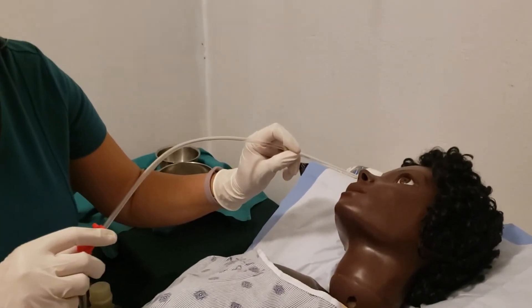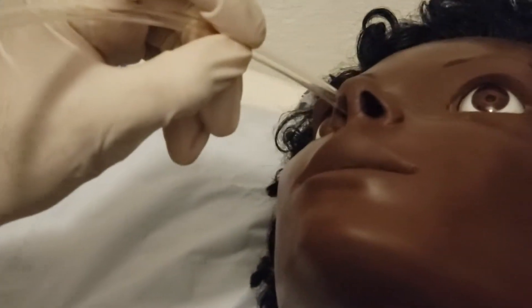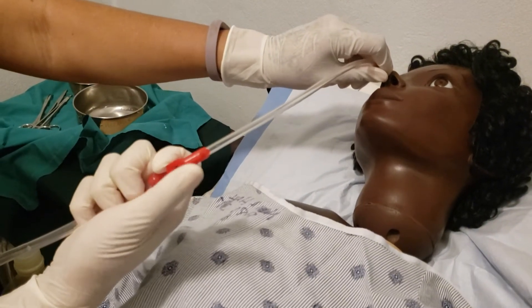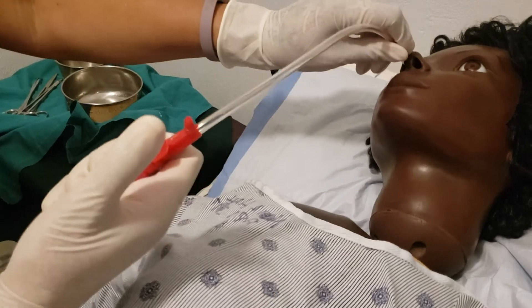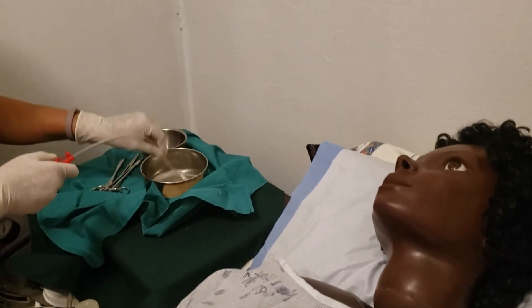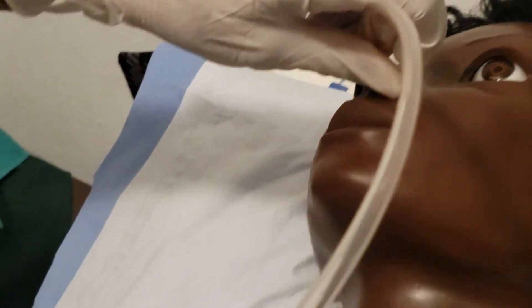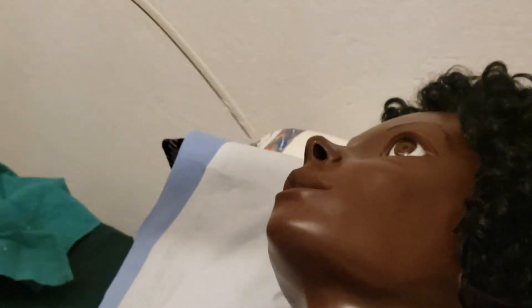Once we go in, we want to make sure that we go along the floor of the nasal passage and go gently — do not force it. We put the machine on and go all the way in as far as we should. Then we are going to pinch right here — this is the suction. You don't want to suction for more than 10 seconds. You pull out while you're suctioning, and then you can rinse it off in the sterile saline water. You might want to put a little more lube and go back in, staying on the floor of the nasal passage. Once we go in, we create suction by closing off. Remember not to stay longer than 10 seconds, and we come back out.